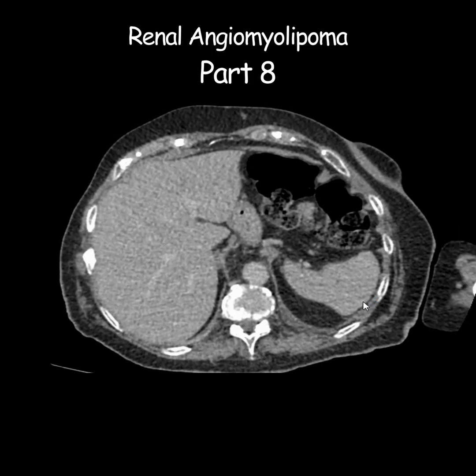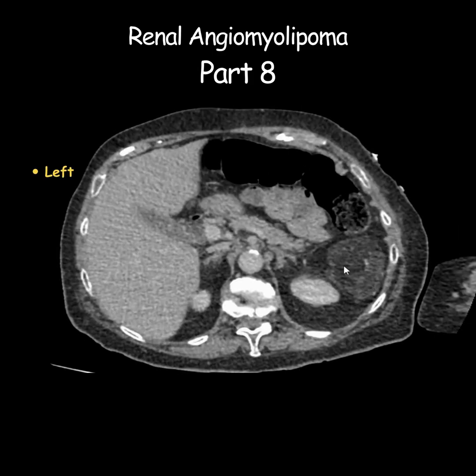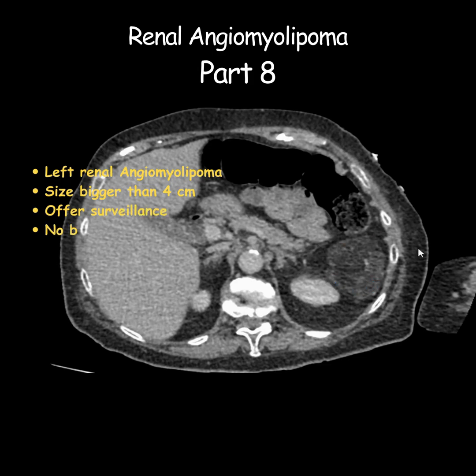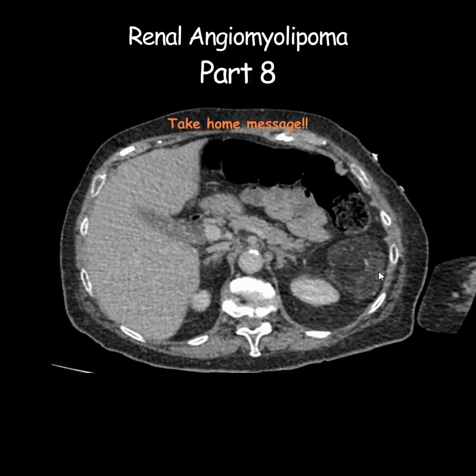To put it all together, in the conclusion of the report, I would say that there is a large left renal angiomyolipoma. This is a benign tumor, but given its size — bigger than 4 cm — I would recommend surveillance. We didn't have any evidence of active bleeding or malignant transformation at present. The take-home message from this video: always carefully look at the fat, because fat density differences can reveal major findings on imaging.